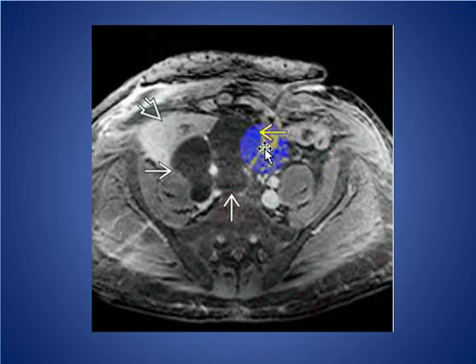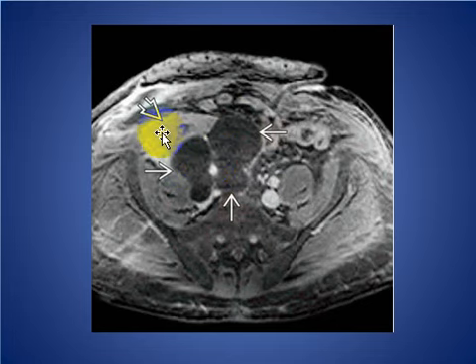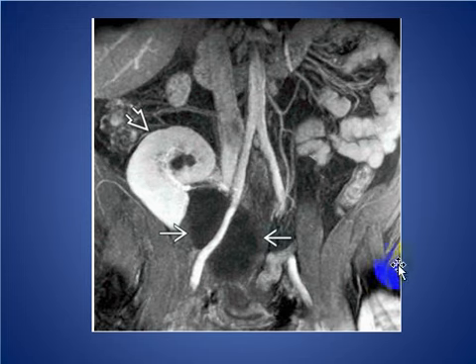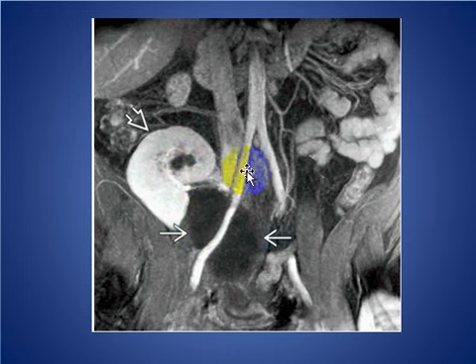Another patient with lymphocele on axial T1-weighted post-contrast fat-saturated MRI shows a cystic mass lesion inferior to the transplanted kidney, consistent with lymphocele. Another contrast-enhanced T1 fat-saturated image shows the lymphocele inferior to the renal transplant with partial obstruction of the collecting system, causing some transplant dysfunction.